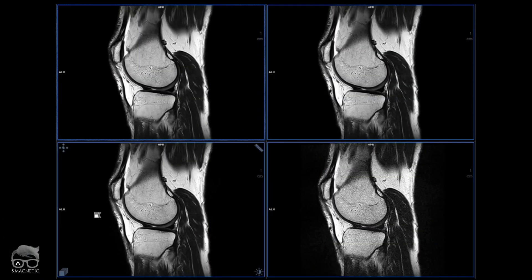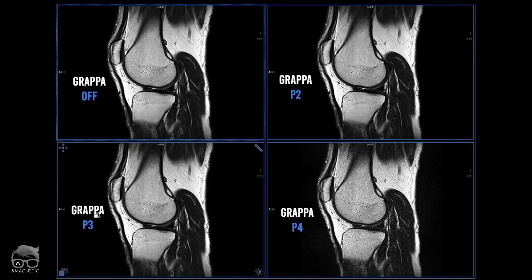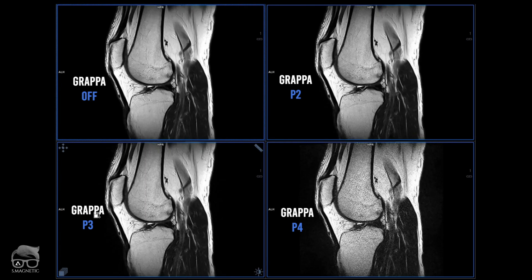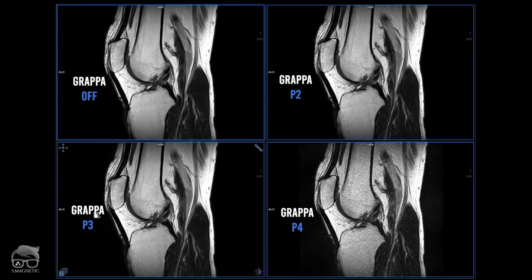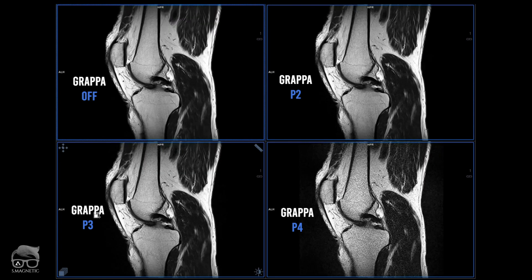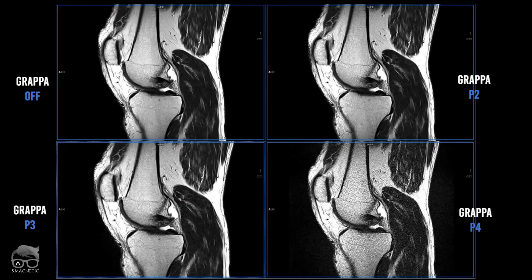Here is the four-image head-to-head comparison: first is PAT OFF, second is PAT2, third is PAT3, and fourth is PAT4. On first look, PAT OFF, PAT2, and PAT3 seem fine. PAT4 shows a lot of noise — look at the muscle tissue, there's a lot of noise there. Let's zoom in a little bit.